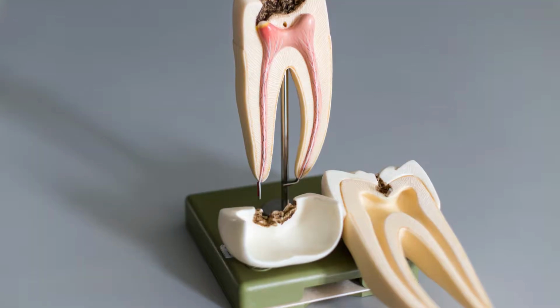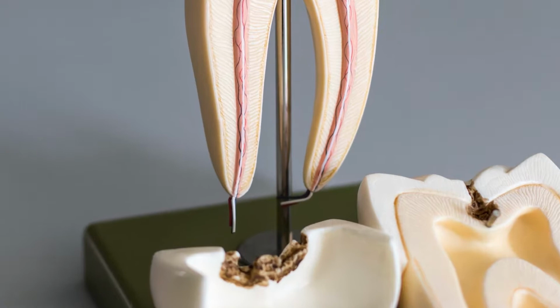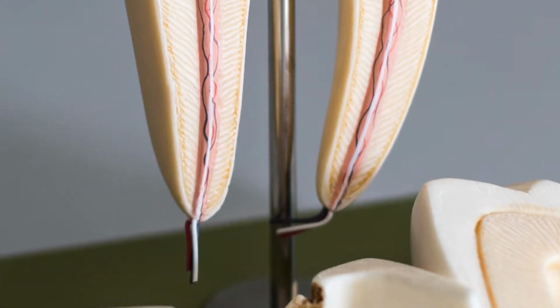Many clinicians will actually say they take a file to working length and they continue to enlarge that apical portion of the tooth until they feel that the file is binding a little bit in the canal or it feels a little tight. Now, in those situations where it feels a little tight or it's binding, then most likely you're cleaning that apical canal space more efficiently than you would be if the file feels loose or it goes to length very easily.